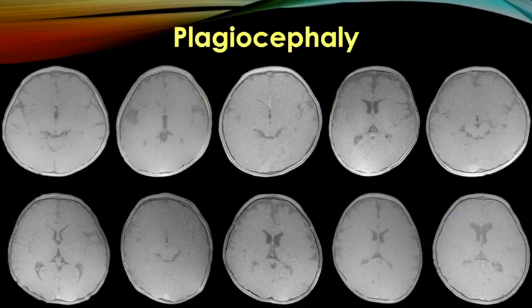One of the best indications for a ZTE MRI is the infant with abnormal head shape. In this setting, the clinicians and parents are looking for some reassurance beyond the physical exam, but they're often not willing to pull the trigger on ionizing radiation. Unossified cartilage in sutures and fontanelles has a short T2, but it's still longer than ossified bone. So essentially on these proton density weighted images, it shows up as brighter.